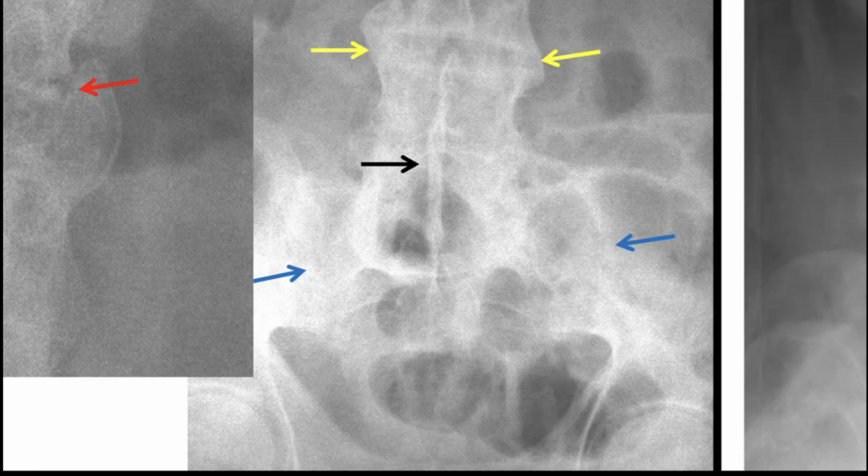Now, here we've actually lost that, and everything's coming back to the original point that I made, that radiography is based on different attenuations of different tissues in the body. If two bones are articulating with one another, the shoulder, the knee, or any other bone, the reason why you see the space is because there is something in there which is not as dense as the bone.